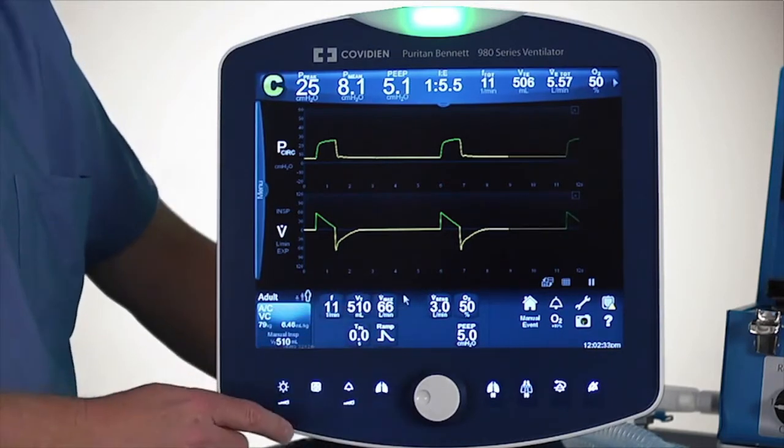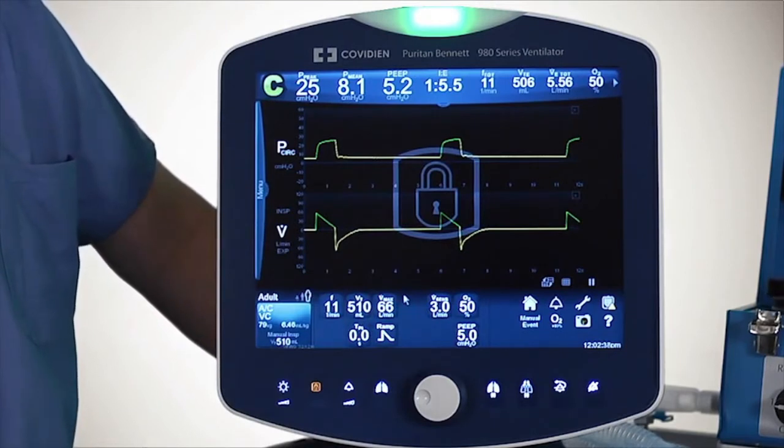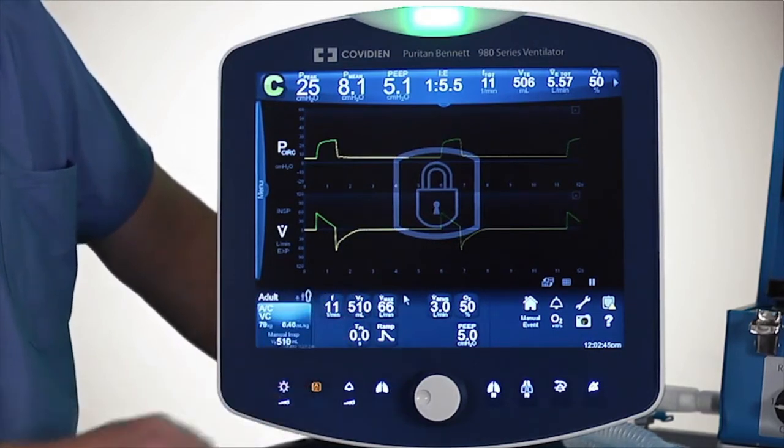The next one is the screen lock. I'll touch the screen lock and a little lock appears. If I try to adjust a setting at this point — let's just say I touch the setting — it won't let me change it. So that's the screen lock.